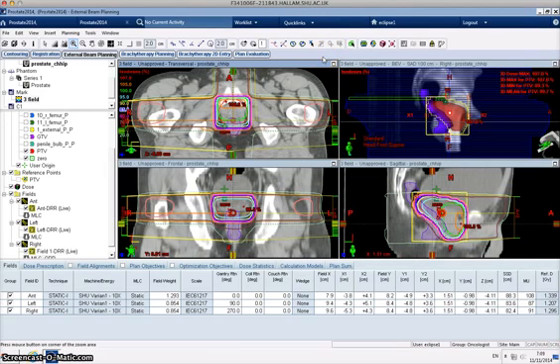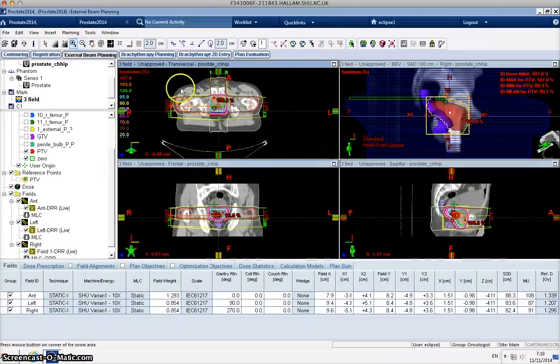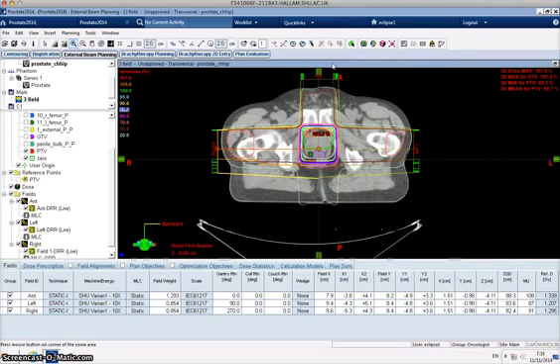So we've talked about in the past in terms of using wedges to counteract the patient shape. So we often need wedges on our laterals. The reason we need it on our laterals is because that's the direction that we want to move the dose in. As I've said before, the easiest way to think about a wedge is like an arrow. So the thick end being the bottom of the arrow, and then the thin end being the point of an arrow. And the direction it points in is the direction it pushes dose.